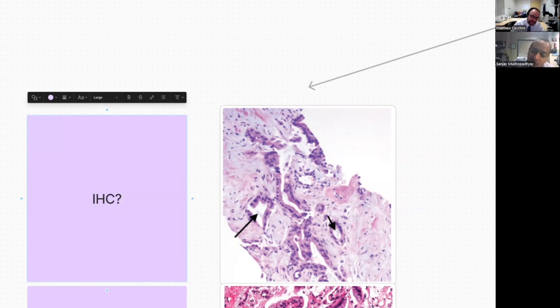Okay, I'll give you what I do in real life, what I really do with these cases. I understand that people who don't have any clinical information, like if you're sitting in a small lab with no access to Beaker or any clinical information, and your clinician doesn't talk to you, you might be stuck. So you really do need clinical information if you want to do the method that I'm outlining. So you need some clinical information like we have on Beaker. All the clinical information that is available to the clinician is also available to me.